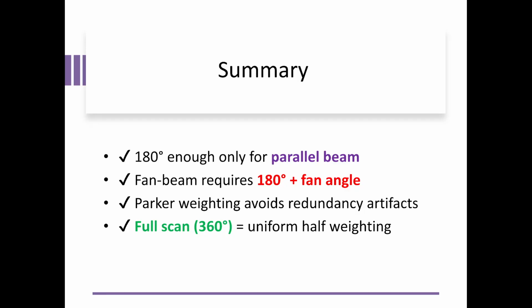Now, one final note. This discussion applies to analytical reconstruction methods, such as filter back projection. In modern iterative reconstruction, you often hear about sparse acquisitions that reduce those. Those methods leverage additional information, such as anatomical priors, cost functions, or similarities across scans. That's very different from conventional analytical reconstruction, which is what we have been discussing here today.